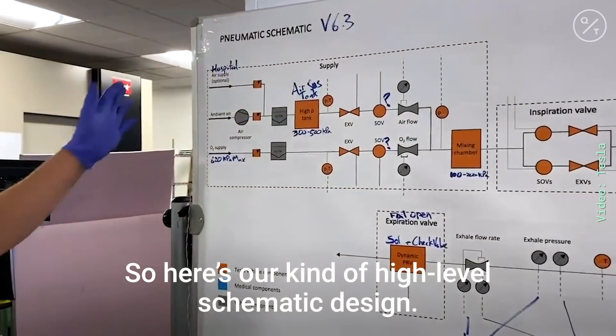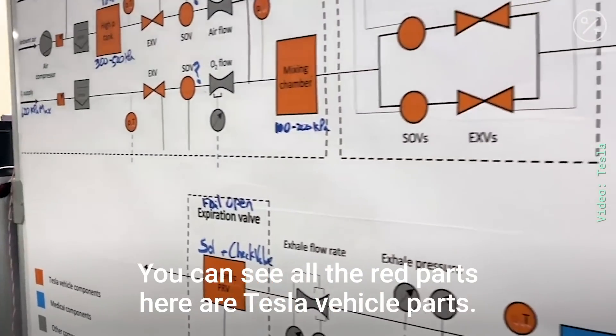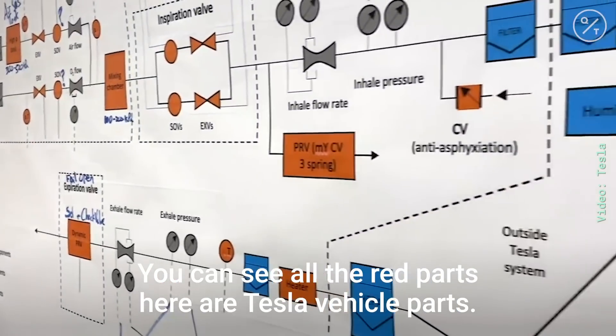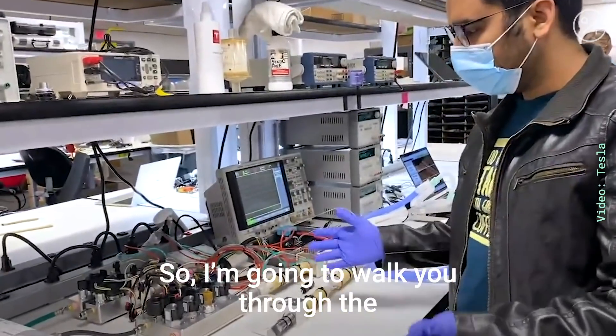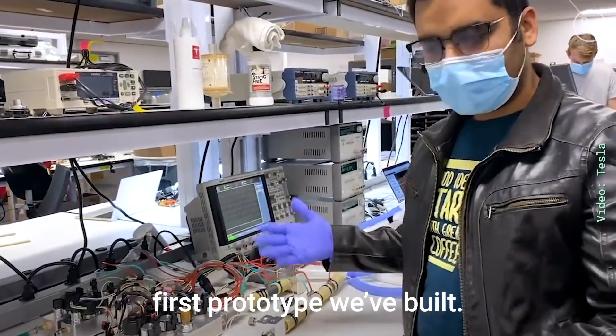So here's our kind of high-level schematic design. You can see all the red parts here are Tesla vehicle parts, so we've used a lot of those. I'm going to walk you through the first prototype we've built.